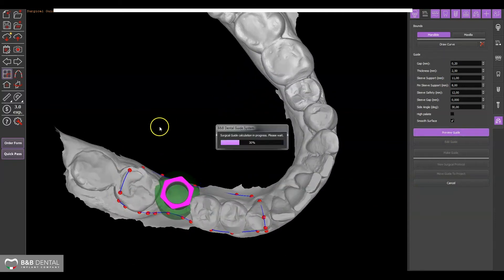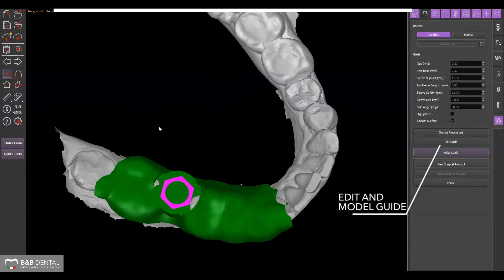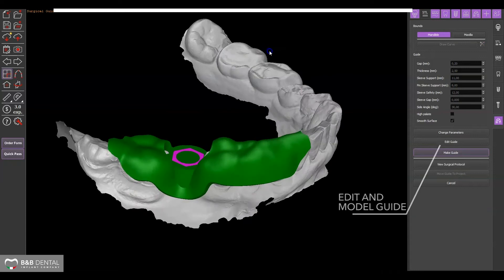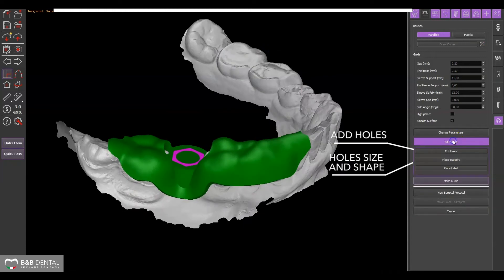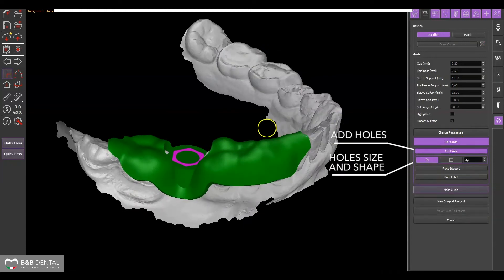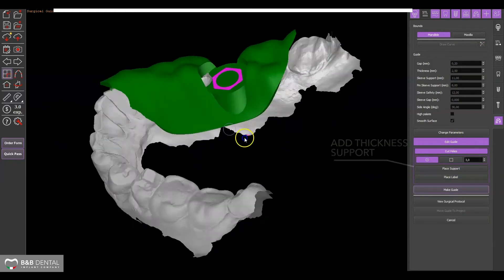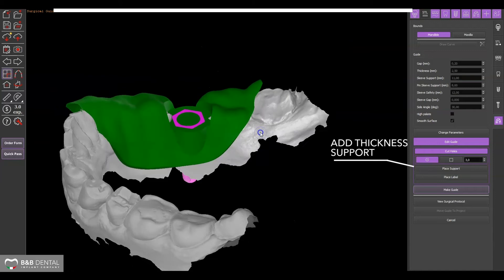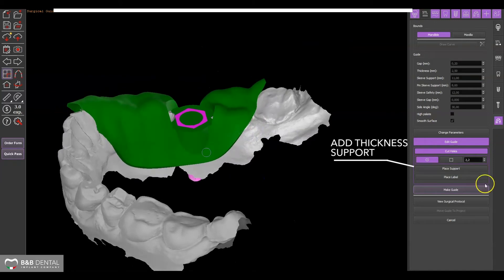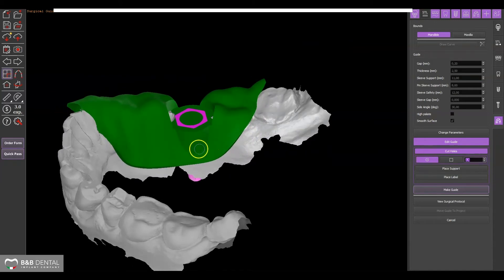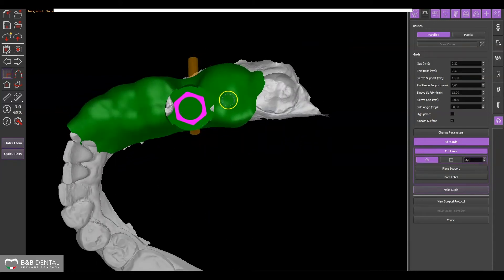Use the edit guide button to add control or release holes and choose their size by using the icons beneath. Click on the template to position the holes. Thickness supports can also be added wherever necessary.